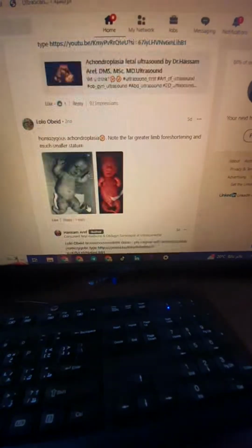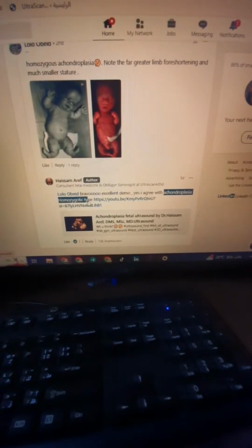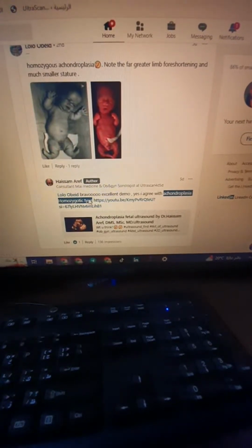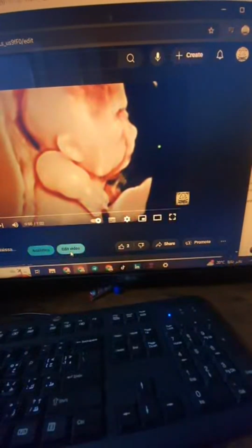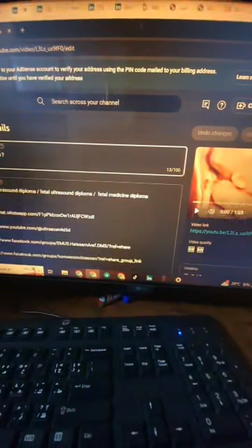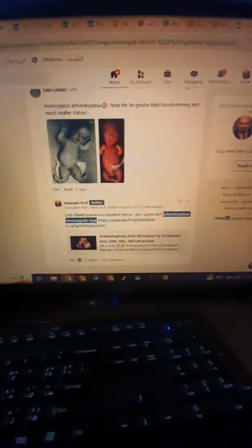So let's take the wonderful comment from Dr. Ala, achondroplasia homozygotic type, and go to our YouTube channel and change the description in this case. We will call it achondroplasia homozygotic type. That was a very good answer. And let's go back to our cases.